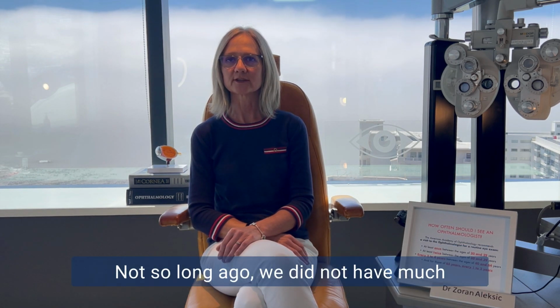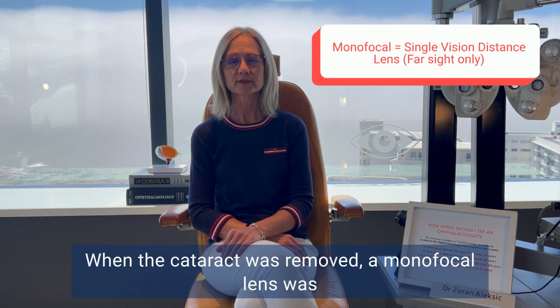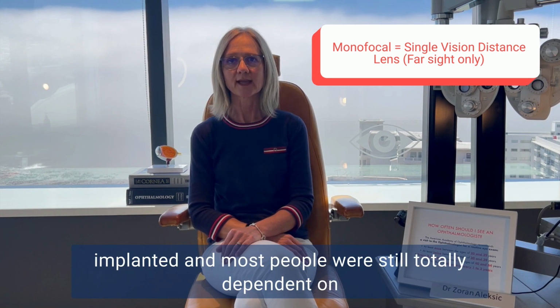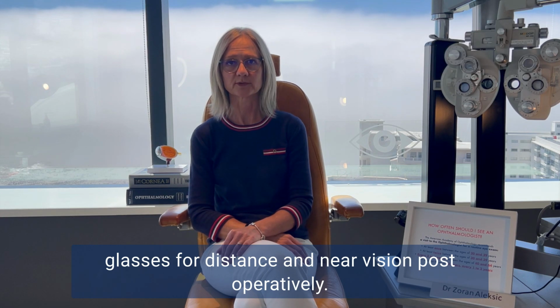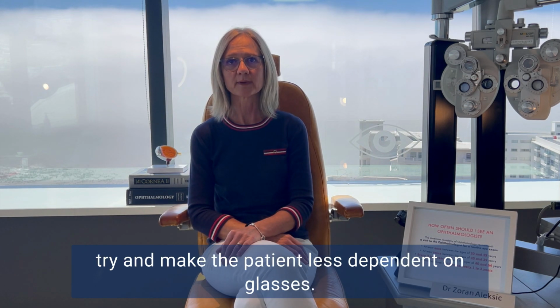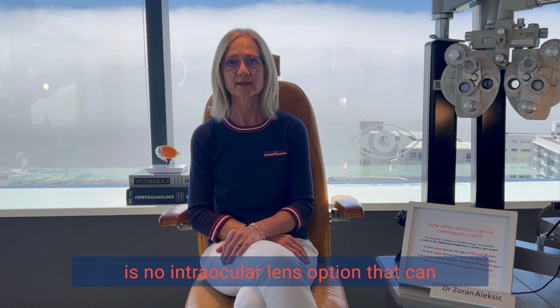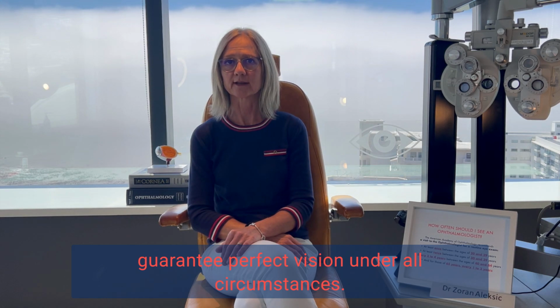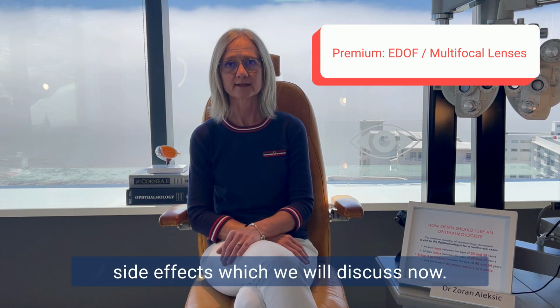Not so long ago, we did not have much of a choice when it came to cataract surgery. When the cataract was removed, a monofocal lens was implanted, and most people were still totally dependent on glasses for distance and near vision post-operatively. Nowadays, there are a number of options available to try and make the patient less dependent on glasses. It is important to remember that there is no intraocular lens option that can guarantee perfect vision under all circumstances. Even the premium lenses have limitations and side effects, which we will discuss now.